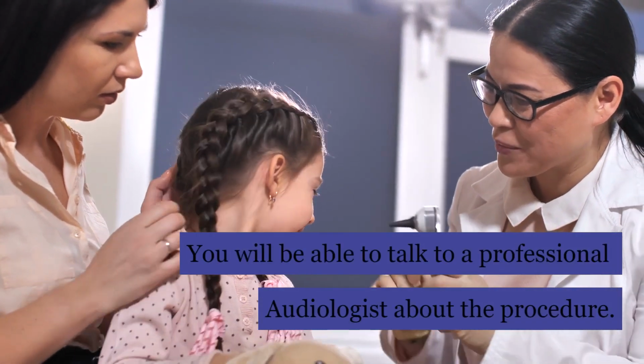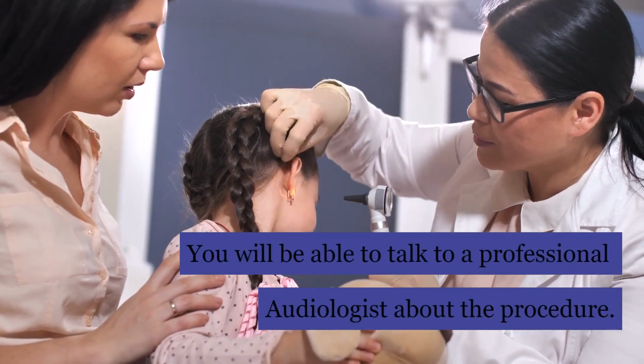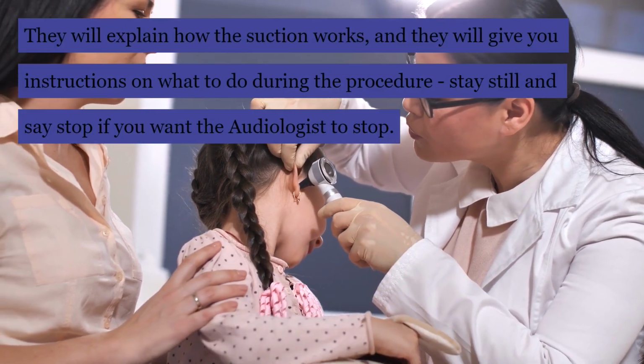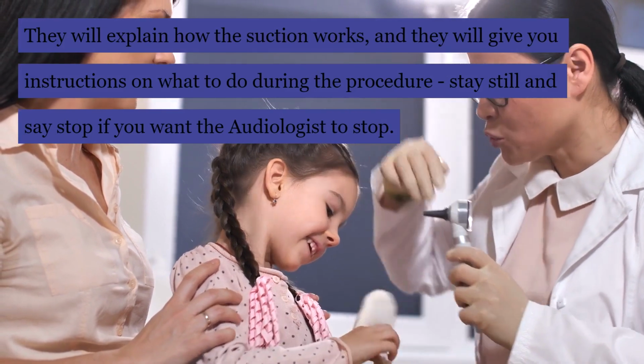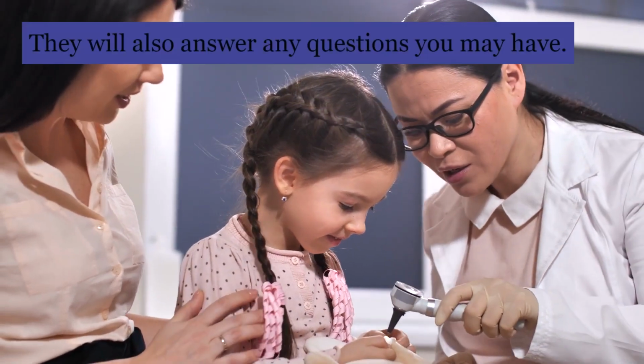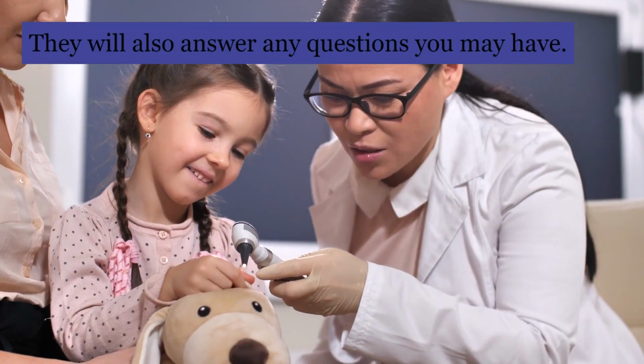What happens at your microsuction earwax removal appointment? You will be able to talk to a professional audiologist about the procedure. They will explain how the suction works, and they will give you instructions on what to do during the procedure. Stay still and say stop if you want the audiologist to stop. They will also answer any questions you may have.